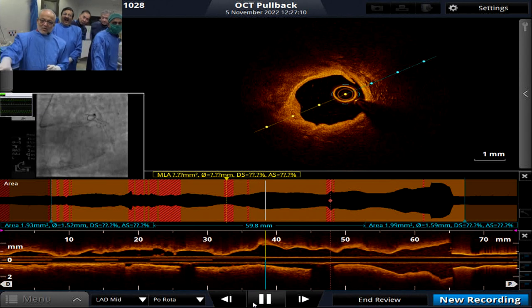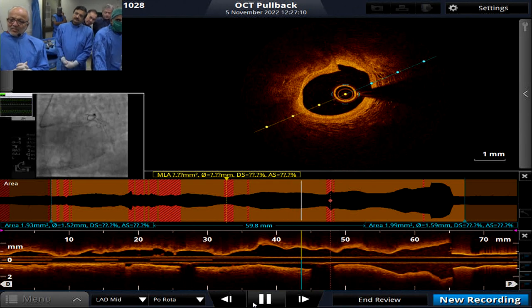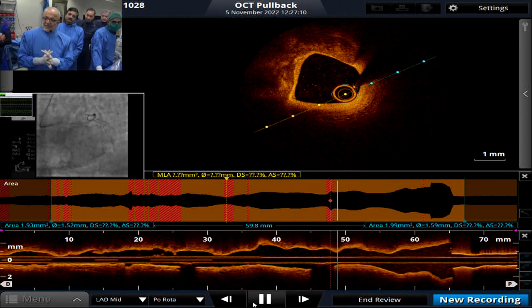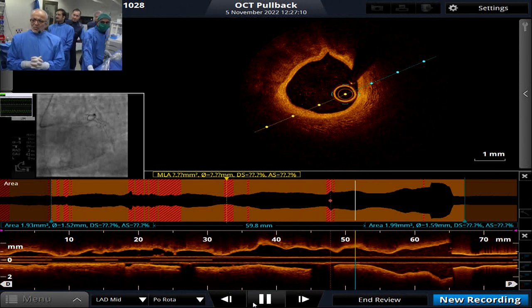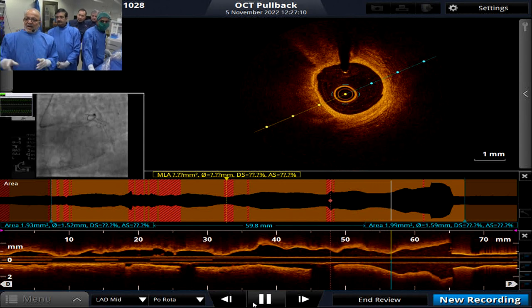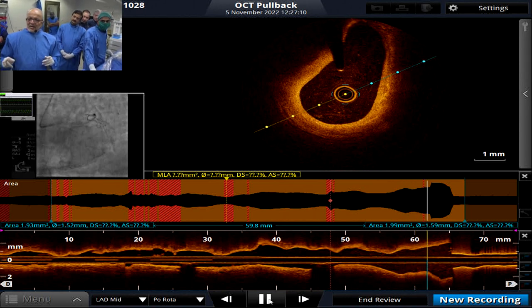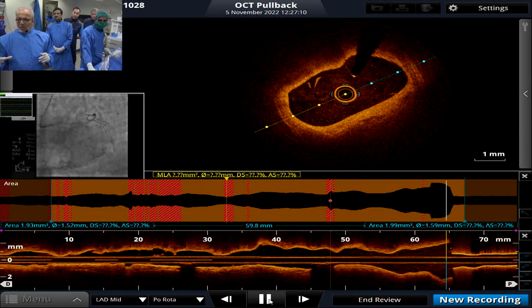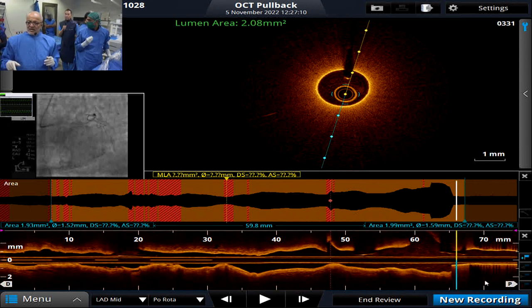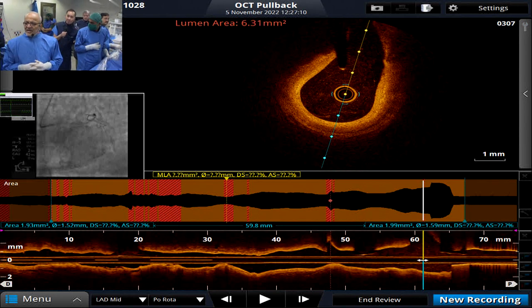In areas of the plaque, you may see that it is a healed plaque, calcium, all those things. And with calcium also, at some places you see TCFA, thin cap fibroatheroma. So although it is calcified, it is a pretty unstable type of thing. And you can see small areas of crack, and that is very typical. With balloon, you see bigger cracks at some places, but most of the places you see small areas of crack. And yeah, now again, just manually show that, just quickly.